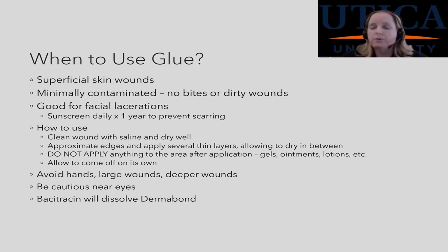So that's what I would tell you. Absolutely not. Do not do it. Don't use it on large wounds or deep wounds. Don't use it. You need to be very, very, very cautious near someone's eye. So if it's very, very close to the eye, unless you are very experienced in using Dermabond, don't. If it's your very first time using Dermabond, don't use it there. Don't let that be your first time using Dermabond, because you don't want to get it in someone's eye.